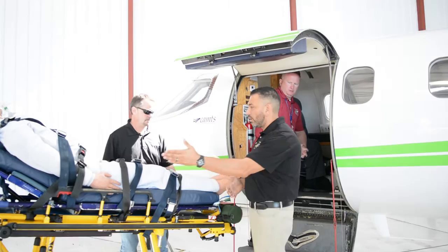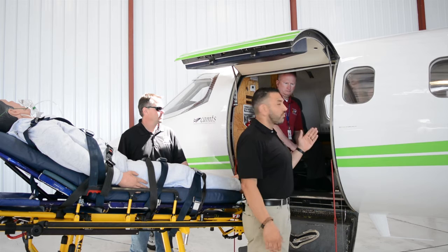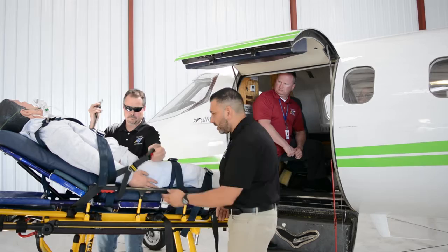Our second in command pilot is usually going to be right here where Aaron is, and he's ready to help with the gurney. And then we have Corey inside, right inside the door, who's going to be helping lift up on the gurney itself as well. So while we bring the gurney up, some points to remember. We want to make sure that we're taking all of the gurney seat belts off, and that they're not hitting anything, that they're not caught underneath the sled that's going to load onto the plane.